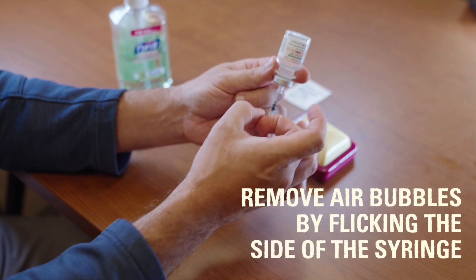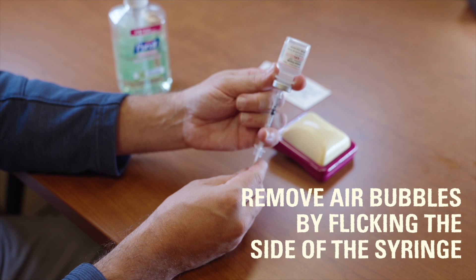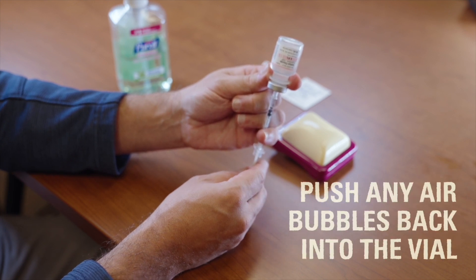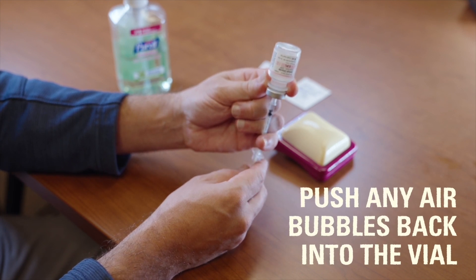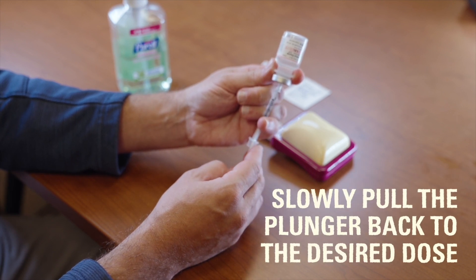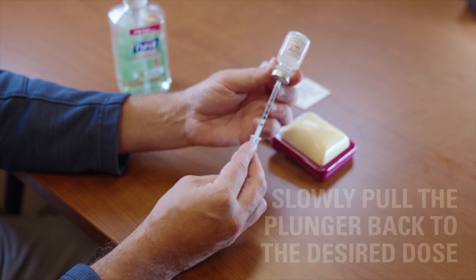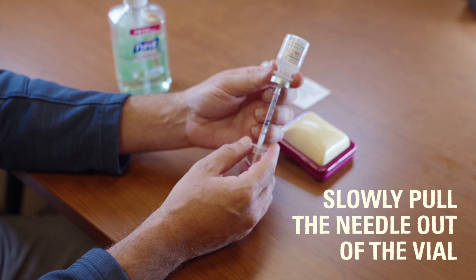Remove any air bubbles in the syringe by flicking the side of the syringe with your finger to move the air to the top of the syringe. Then push the air back into the vial. Pull the plunger back until the insulin reaches the dose line that is needed. When the amount of insulin reaches the marker for the amount needed, remove the needle from the vial.